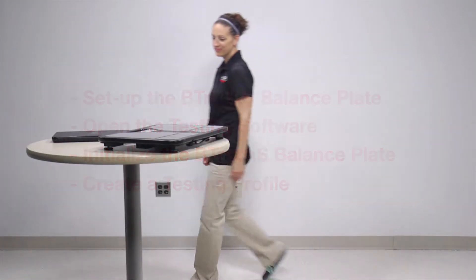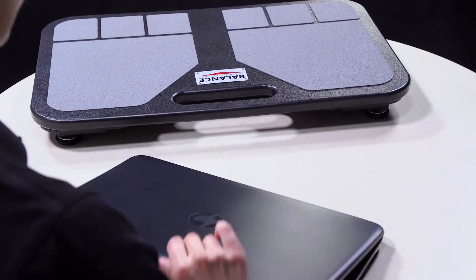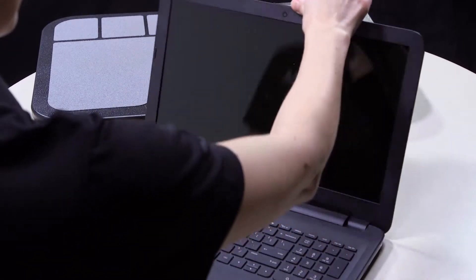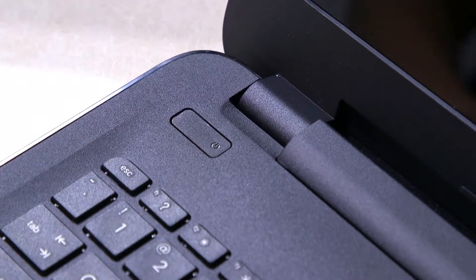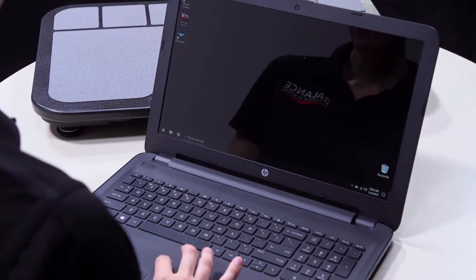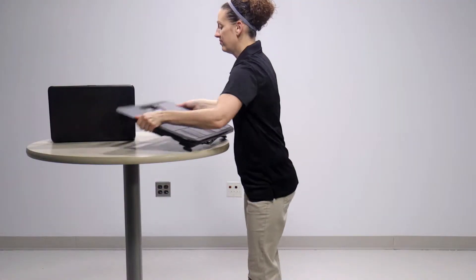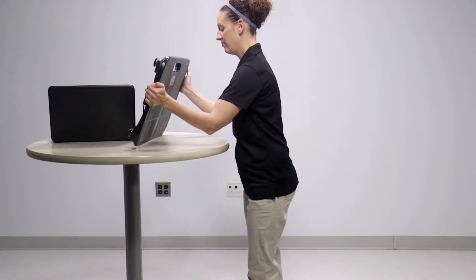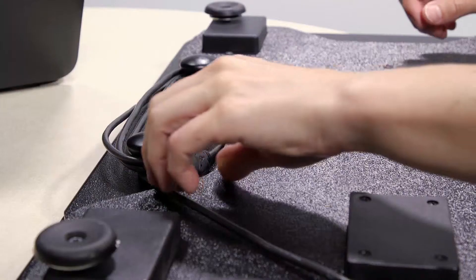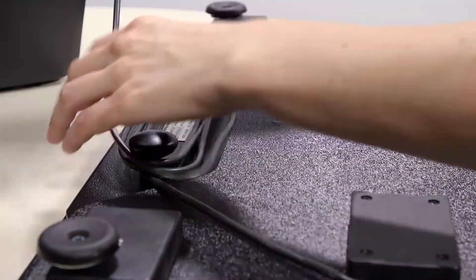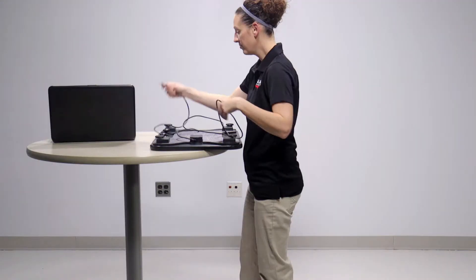To begin, find a quiet space with hard flooring or low-pile carpet to perform testing. Turn on your computing device and double-click the B-Trax icon on the desktop to open the software. Unwrap the cord on the B-Trax Balance Plate and plug it into any available USB slot.